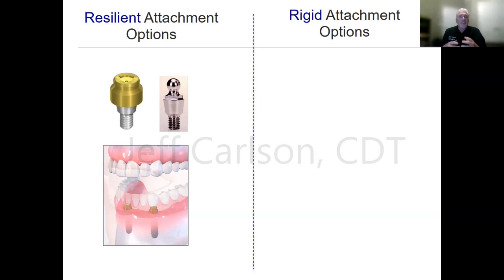So understanding the different attachment mechanisms and their purpose is very important. Now, of course, your knowledgeable laboratories will be able to guide you through this, doctors. If you're not already connected with an implant laboratory that has a lot of experience with implants, they can really share a lot and help you along this road.